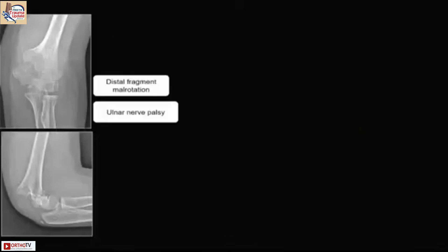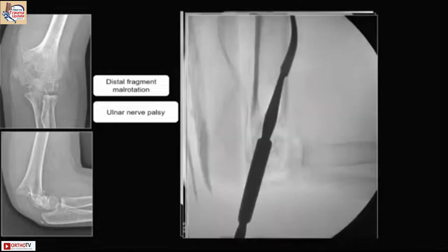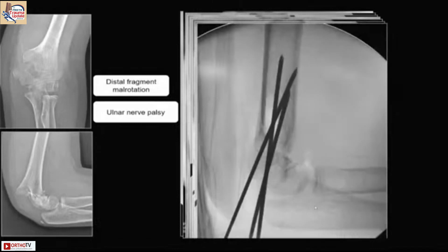Here is an example: the distal fragment was mal-rotated and there was ulnar nerve palsy. I attempted all closed reduction techniques but nothing worked, so I had to open it. You can see the arthrogram. After open reduction it was pinned, and that is the end result.